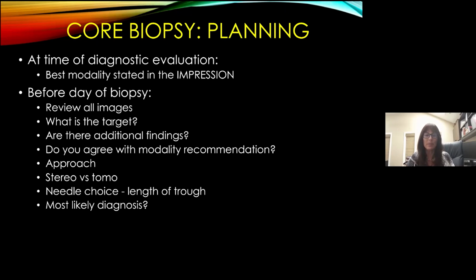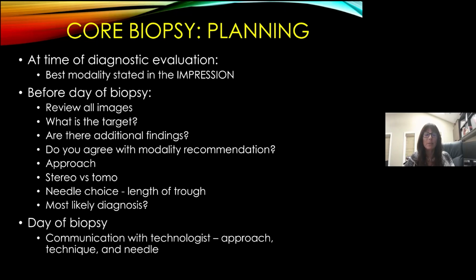Do I need a petite? Do I want to come with a lateral arm approach? And what do I think is the most likely diagnosis? This is somewhat time consuming, but very important to go through all of these steps prior to the day of the biopsy. The day of the biopsy, everything's already been figured out. You just need to communicate with your technologist. What's the approach, the technique, and which needle you would like? Also, go over the images with the technologist so they know exactly what the biopsy target is.